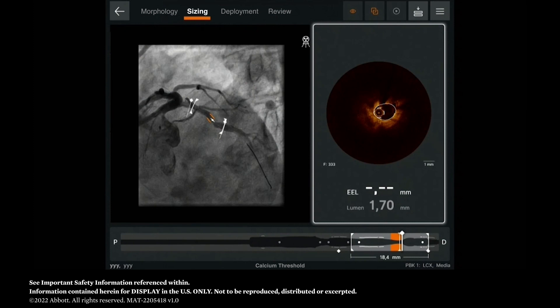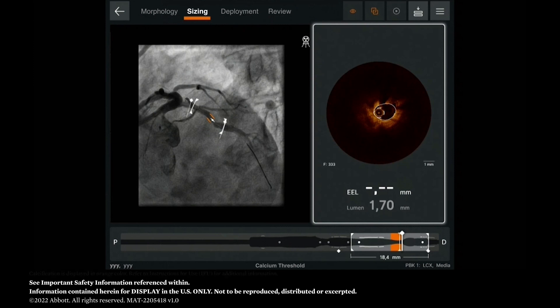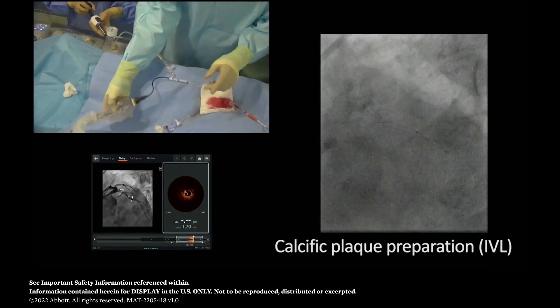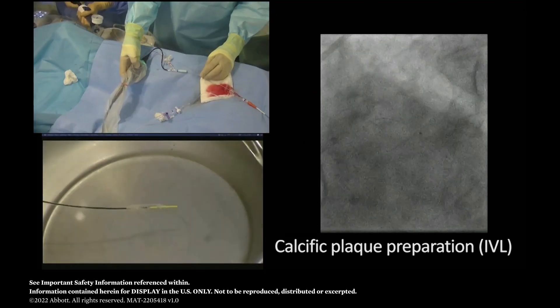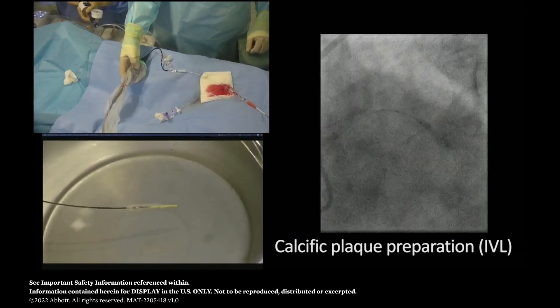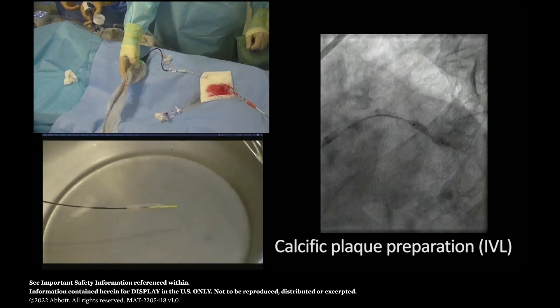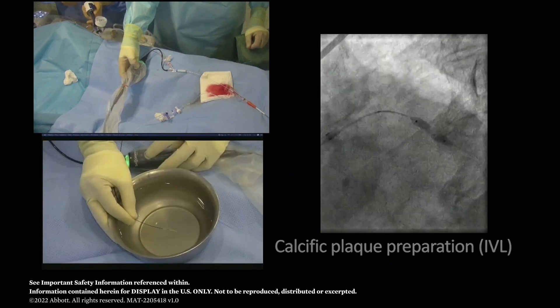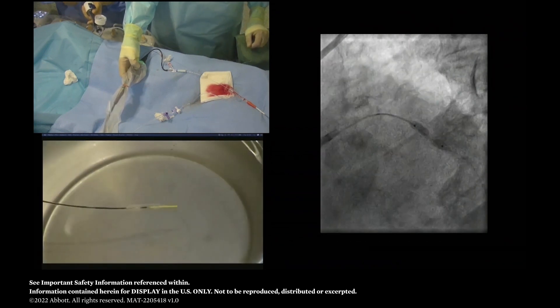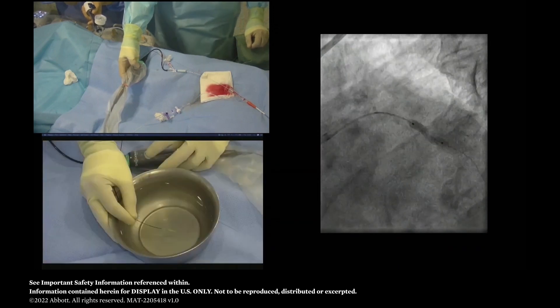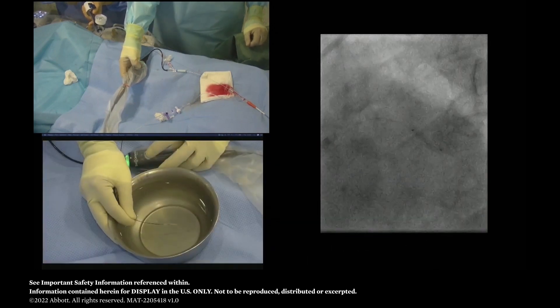Here you can see in this view the two references we have selected in white, and in yellow is the area of calcification that we're going to be treating. We go to four atmospheres. We start — we are showing you basically the way that lithotripsy works. You are seeing some images at the same time that we are performing the actual case. You may see the generation of the bubbles, the same bubbles that you see on the top.